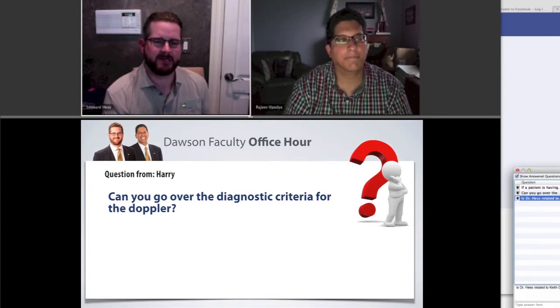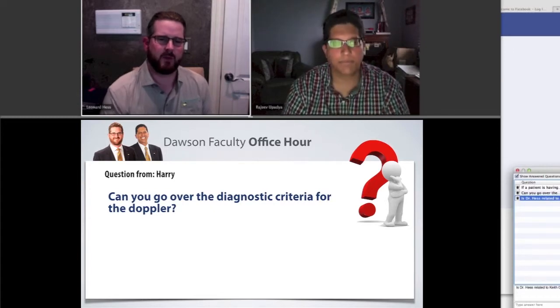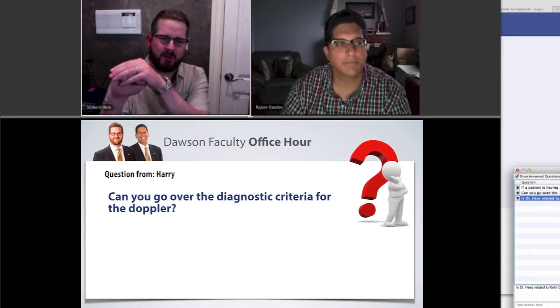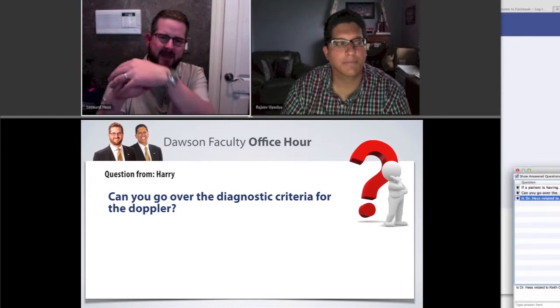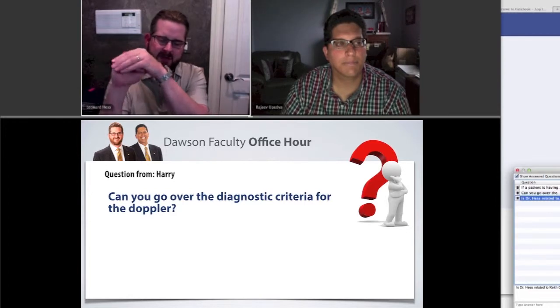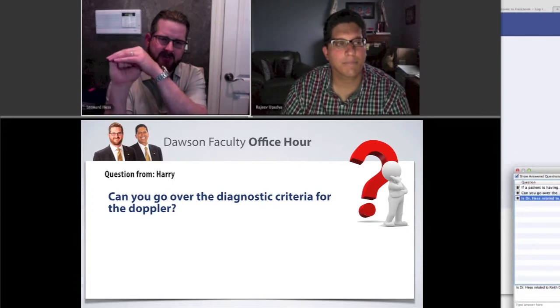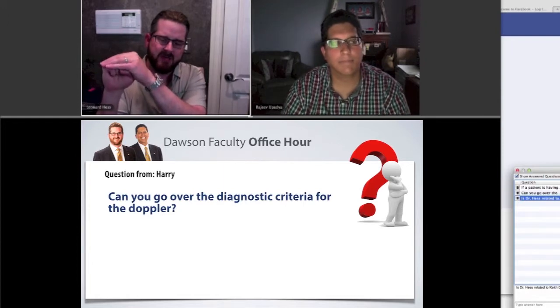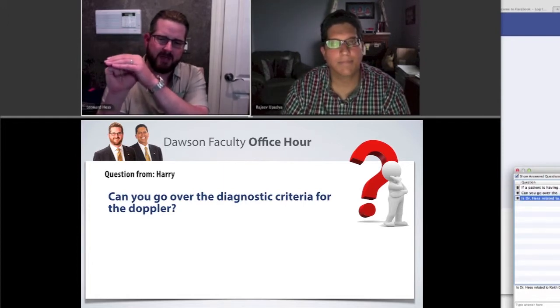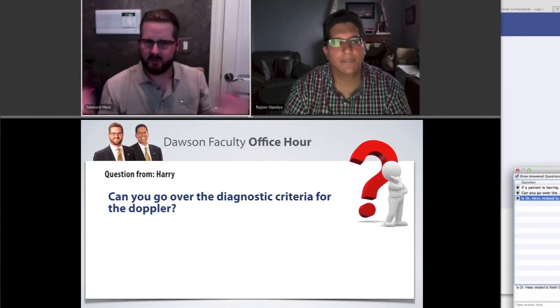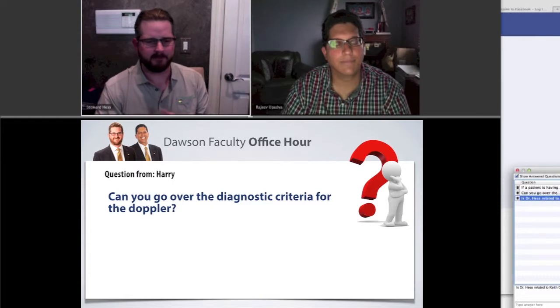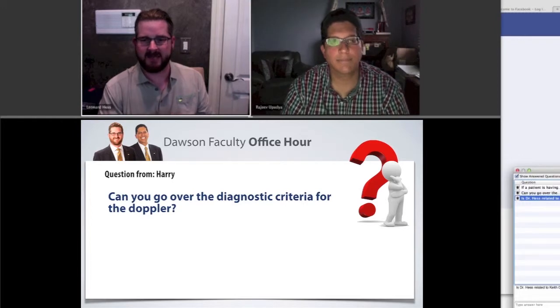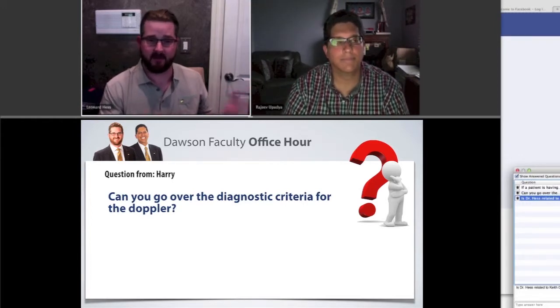Then we listen to the position of the joint. If we have our condyle with the disc sitting on top of it, everything in its proper place, bathed in synovial fluid — the first 20 millimeters of opening is all rotation of the condyle in the glenoid fossa. If that medial pole is in its proper position and bathed in synovial fluid, when the patient is slowly opening and closing in rotation, we should hear nothing at all. That's what we'll hear in a lot of patients, which means the medial pole is intact. We do that the same for both sides.